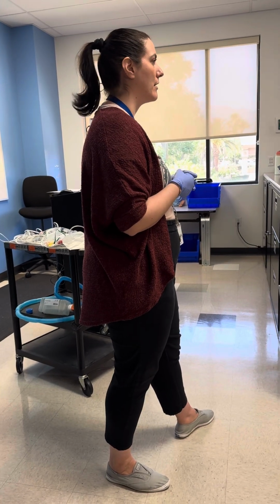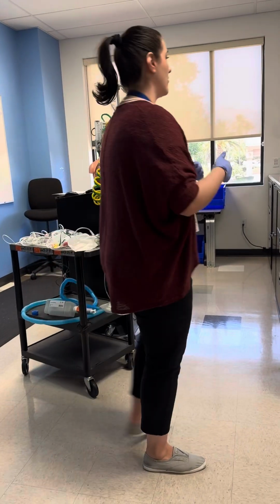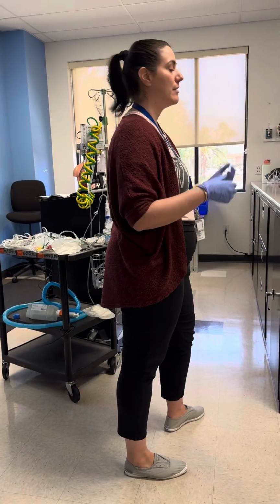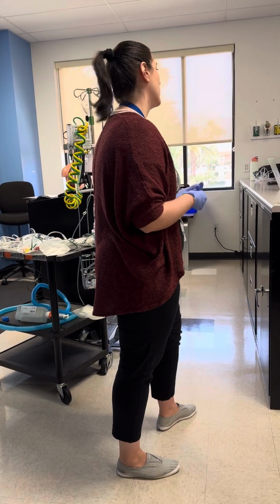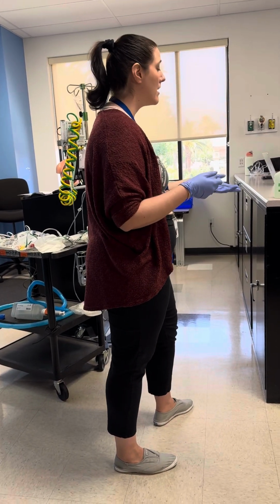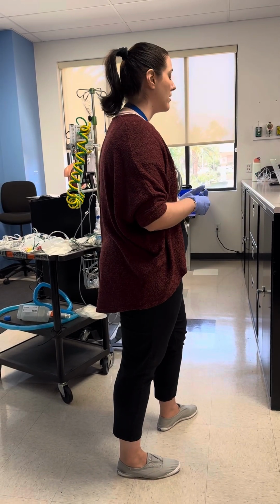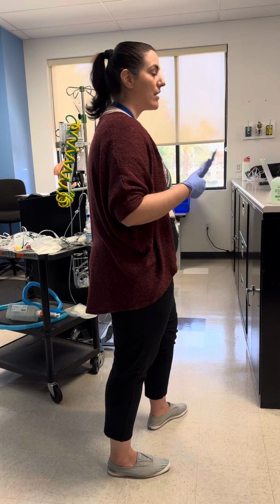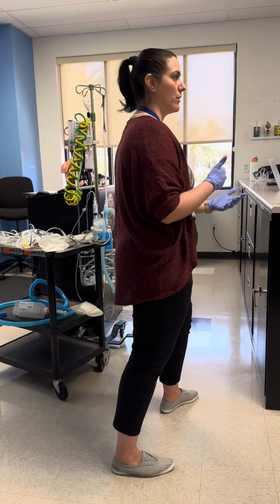Looks like you're pretty stable right now, which is true. All right, Mr. Lennon, I'm Lillian of your RT. I'm coming in to give you some oxygen therapy. I've decided to give you something called an air entrainment mask. I am a little concerned about you having something called COPD, and because of you having that, I want to make sure that we're giving you the precise amount of oxygen necessary in case of you having any issues with that COPD. So I'll teach you a little bit more about this air entrainment mask as we go through it.